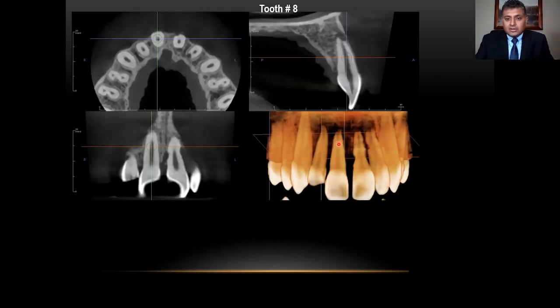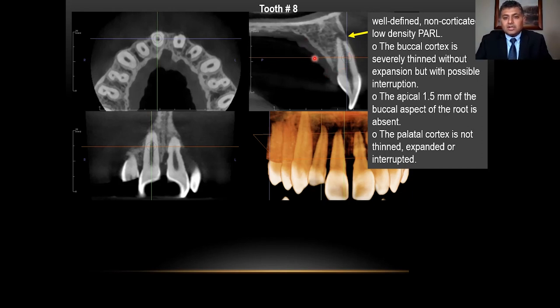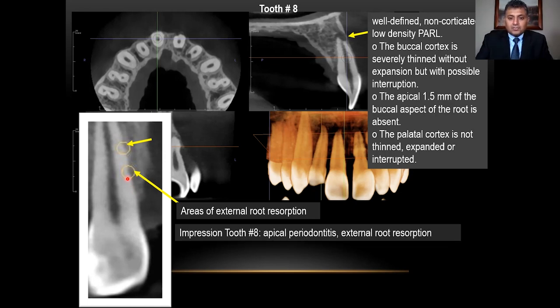Looking at tooth number 8 on the same scan: there is periapical radiolucency. The buccal cortical plate shows thinning but no expansion; the palatal cortical plate looks unremarkable with no breakdown. On tooth number 8, there are very small areas of external root resorption. The impression for tooth number 8 is apical periodontitis along with external root resorption.